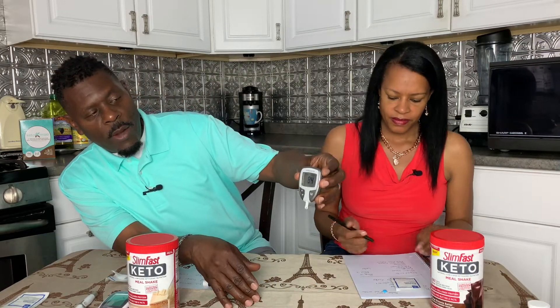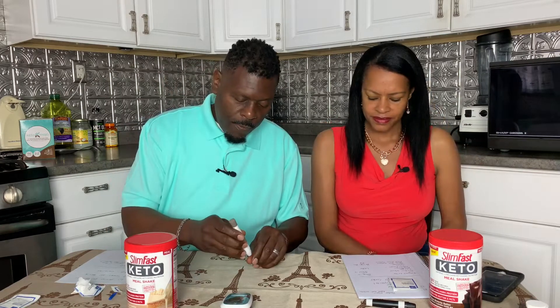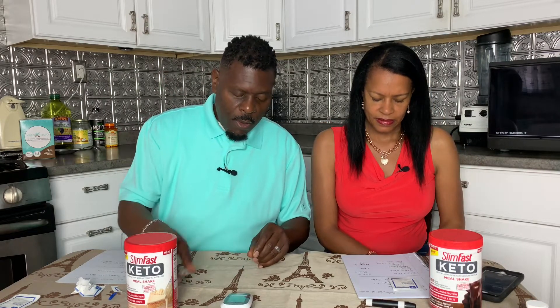So we're going to do the pre-glucose test. Renee's reading is 84. And David's is 96. Now that we've taken our pre-test, we will taste the product and then come back and test our sugar.